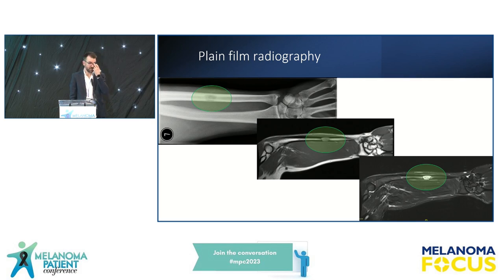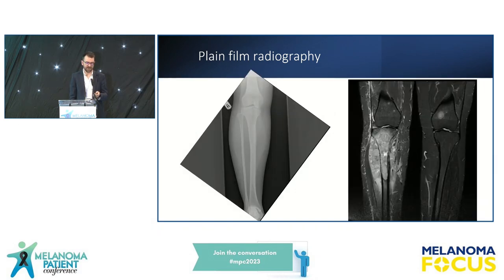And the patient was referred on to our orthopedic colleagues. They popped a plate across it to reduce the risk of it fracturing. And then I think he went on to have radiotherapy to that area. So in this case, the x-ray was very, very useful. However, it doesn't always pick up the deposits in the bone.